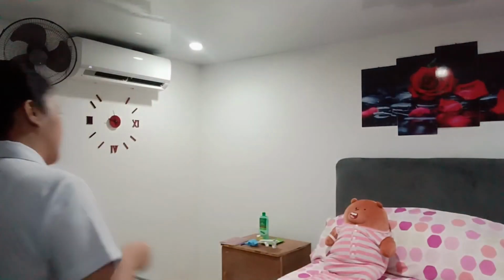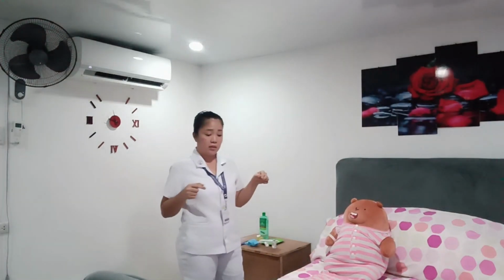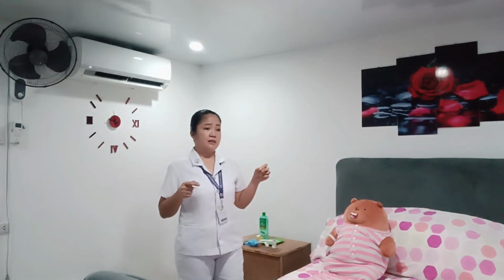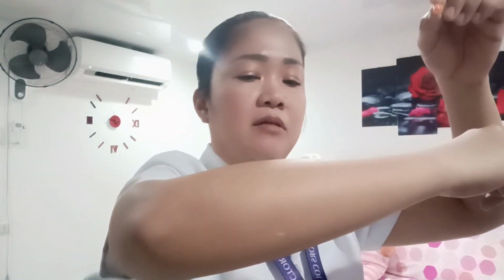Now, if we're going to inject insulin in the stomach, rest assured, if your client is thin or skinny, you have to pinch the skin, not the skin, the dermis. You have to do it like this, and then inject it at 45 degrees. But if she has good fat, you don't have to grab the epidermis or the dermis. Just inject it right away.